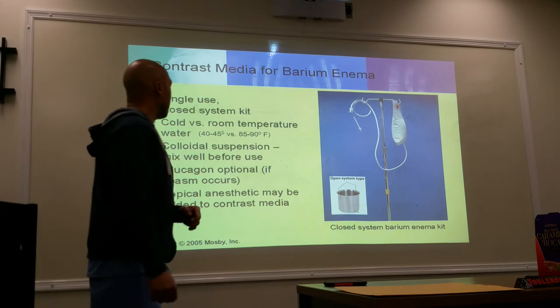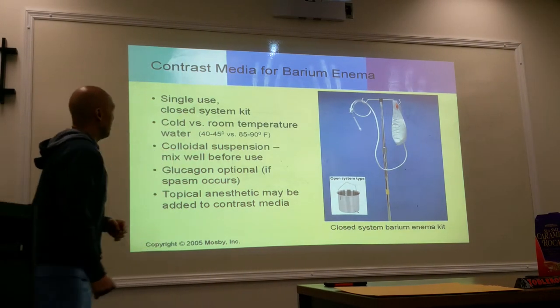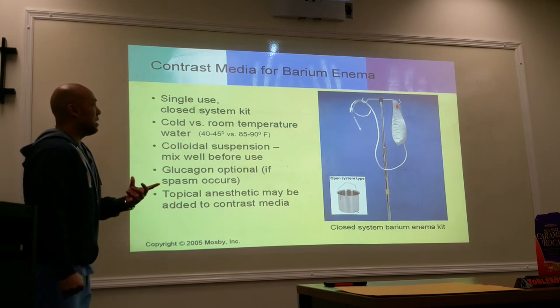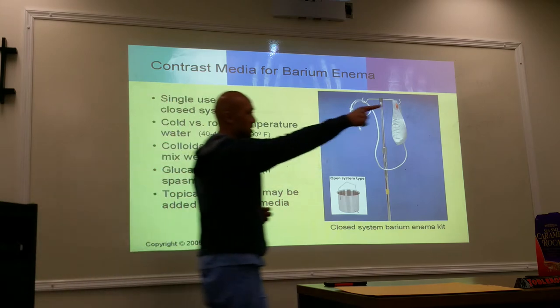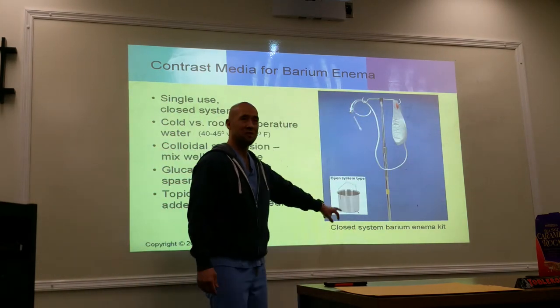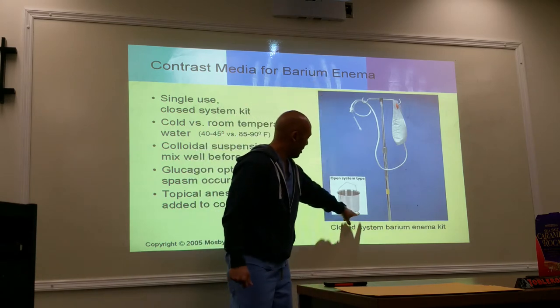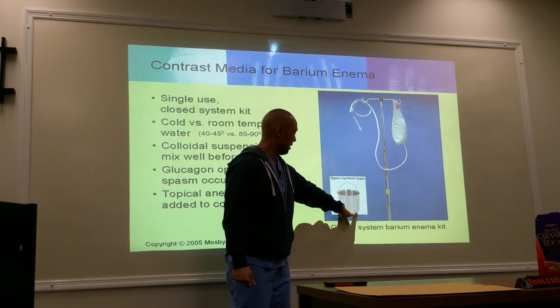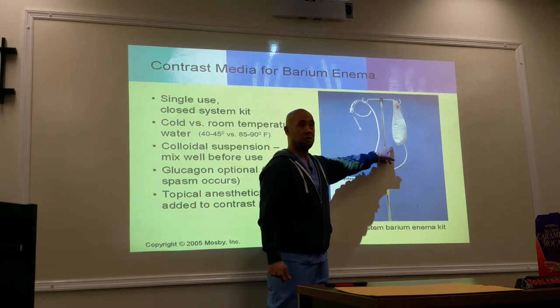So, contrast media that we're going to use for barium enema. The system that we have is for single use and it's a closed system. This is a closed system. They didn't have any pictures of what an open system was. This is an open system. It's basically a receptacle. You just pour the barium in there. You connect the tube to this little nipple or nozzle here. But that's an open system versus a closed system. Open, closed. Okay?